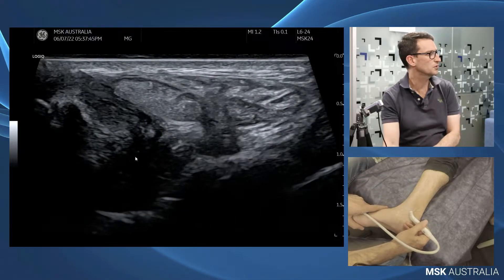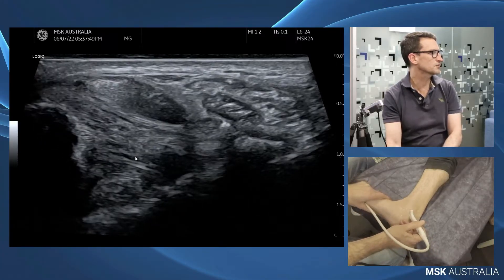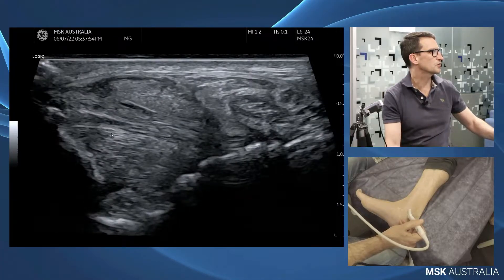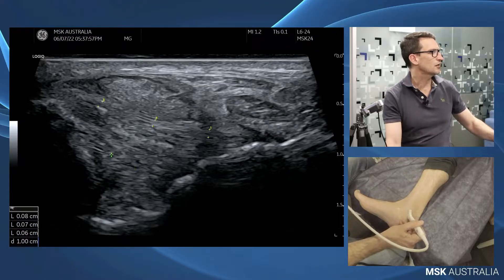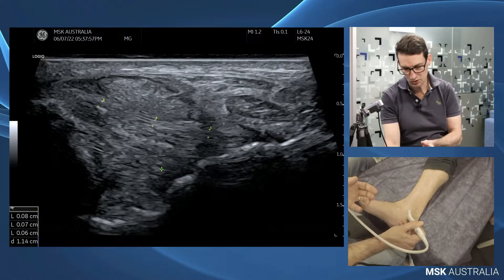I can make that look very pretty by just putting it on tow. So we just plantar flex — sometimes a little eversion will help — and we can see here we've got lovely components of our ligament. If we freeze this, we have a superficial component of our posterior tibiotalar ligament and then we have our deep component through here. This deep component is covered in synovium, and this is the area where we can get lesions when we pinch this ligament off and irritate it with inversion injuries.